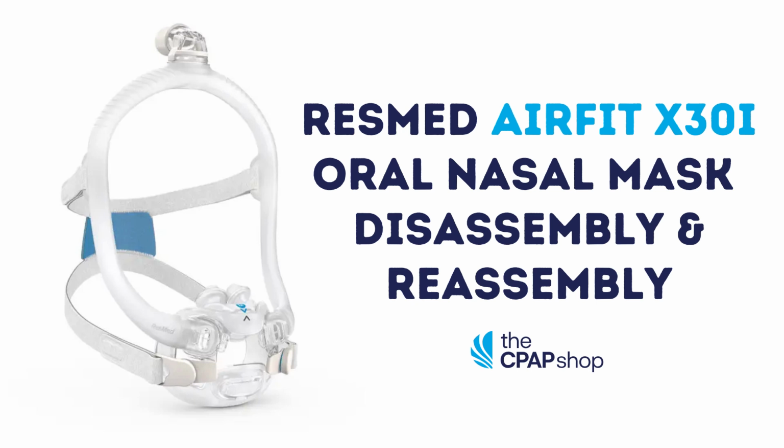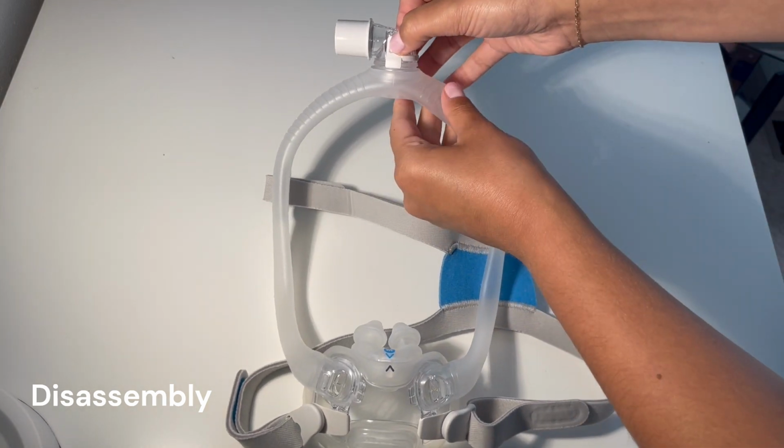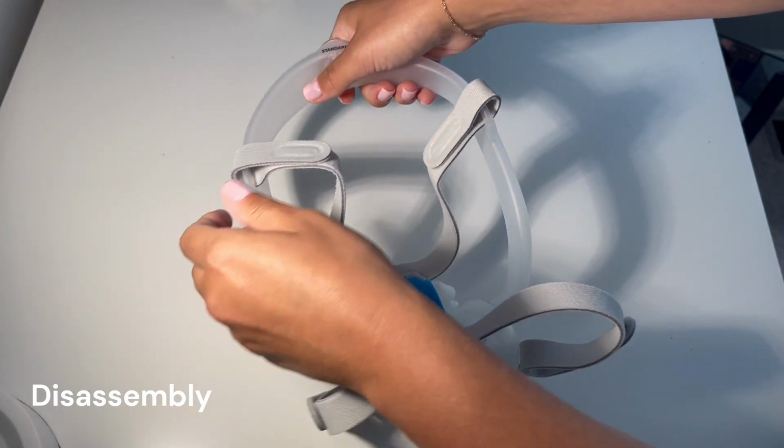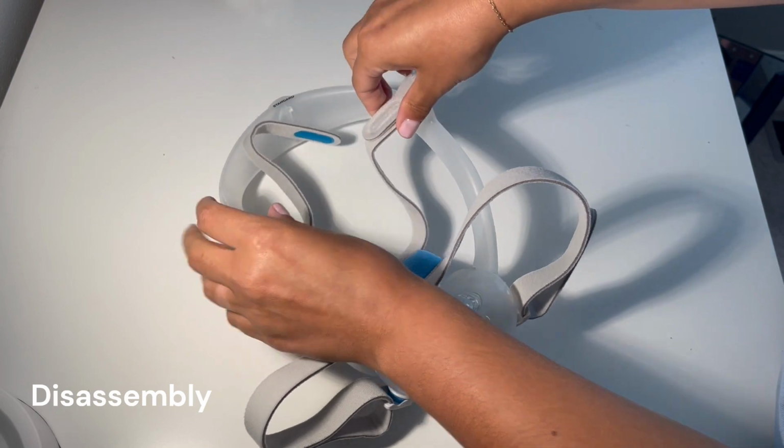Learn how to disassemble and reassemble the ResMed AirFit X30i mask in this video. To disassemble, first start by squeezing the side buttons on the elbow and detach it from the frame. Then, undo the fastening tabs on the upper headgear straps and pull them out from the frame.